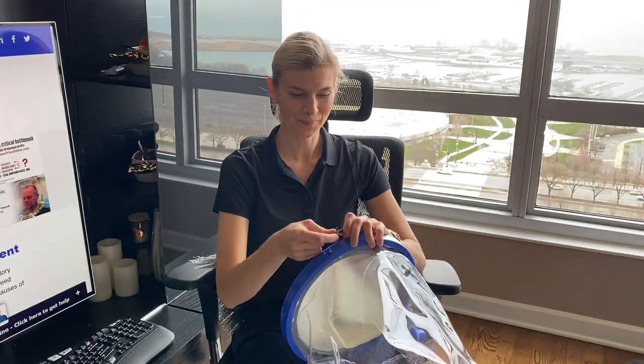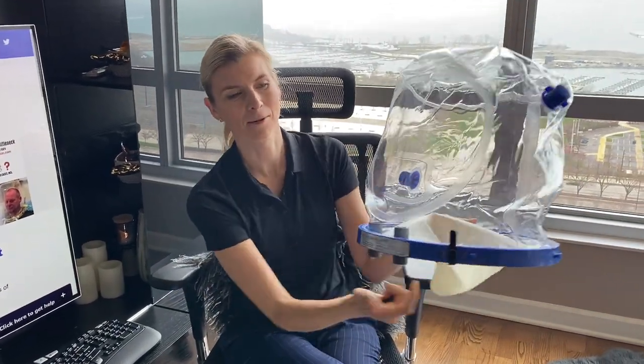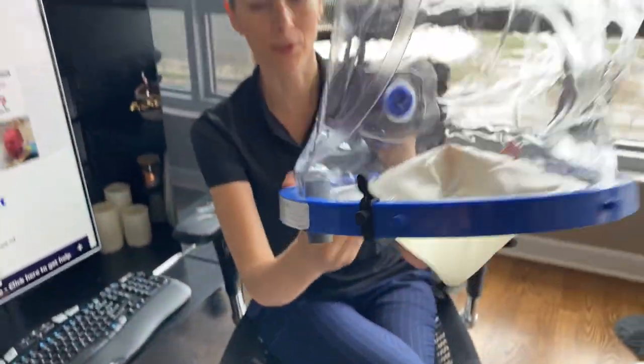So here we go — this is how it looks. We have four of them and you put them around.